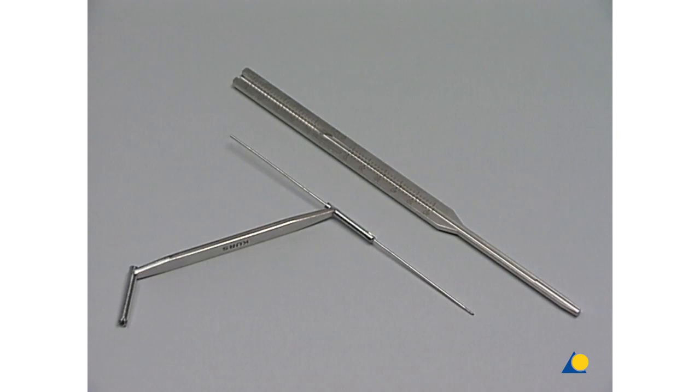For the implantation of the cannulated screws you will find the following instruments at your table: a tissue protection sleeve, threaded guide wires, and the direct measuring device to determine the correct screw length.